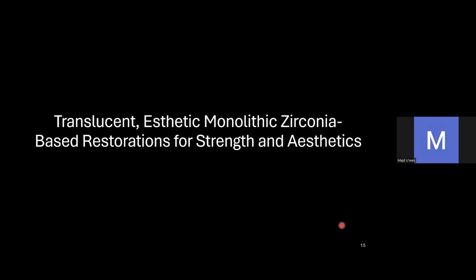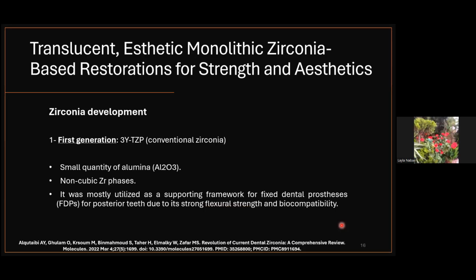Now, the next topic, translucent aesthetic monolithic zirconia-based restorations for strength and aesthetics. So the best way to understand this version of zirconia, which combines the advantages of both aesthetics and mechanical properties, is by going through zirconia development. Regarding zirconia development, there were 4 generations.